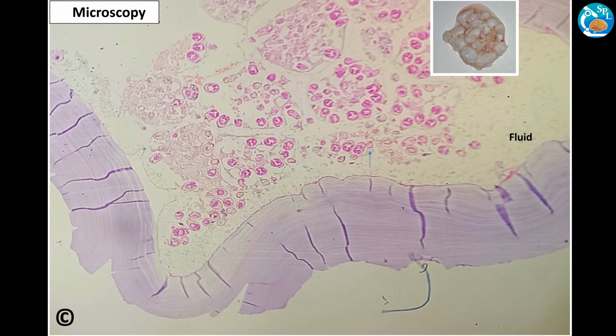So the microscopy revealed a cyst wall with three structural components. The outermost is the acellular laminated membrane. Next comes the germinal membrane, a transparent nucleated lining, which you can appreciate here, and the protoscolices within, which are found attached to this membrane and budding from it.